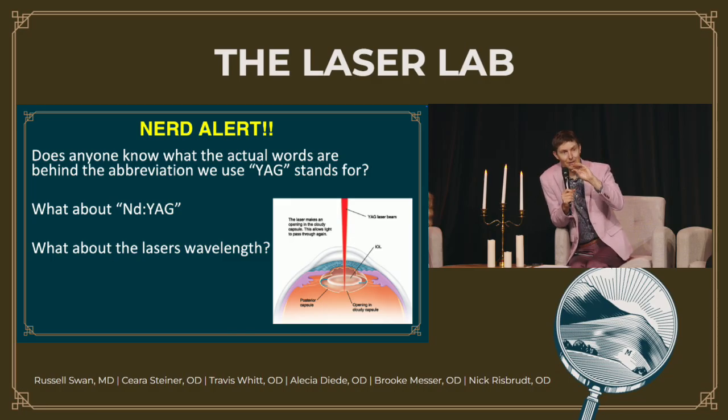And the little capsular remnant just popped. That was great. I was like, wow, that was awesome. And then the lens just fell backwards as I was watching it. And it went from 20/20 to hand motion immediately. And I've never been so devastated by any of my YAGs before.